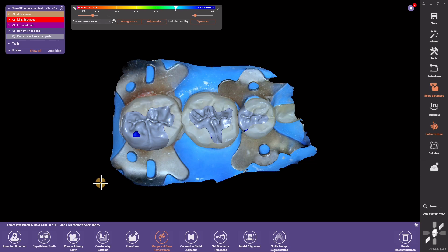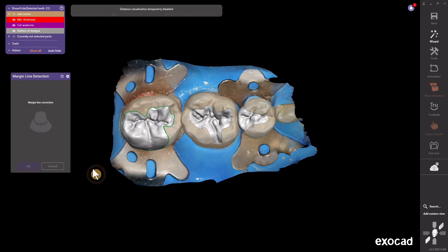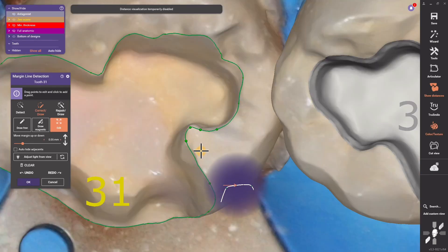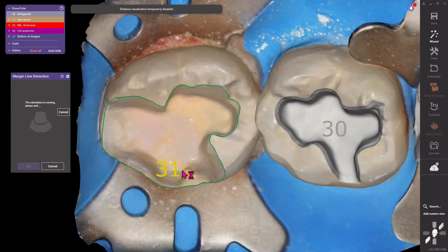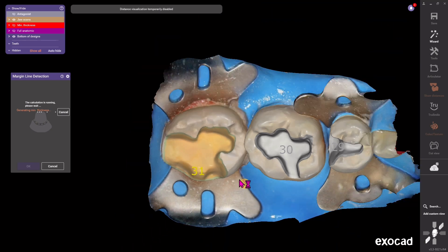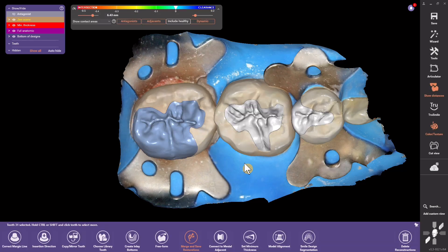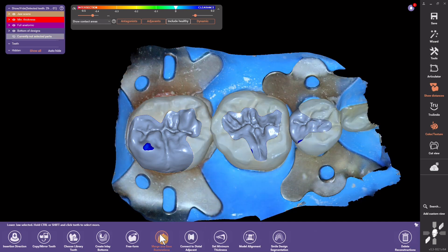If you want to change a margin, click one of the teeth in the group, go to the Margin Line, and tweak it — maybe it had an open margin or you drew it weird. Hit OK and it's going to modify the bottom of the restoration without messing up the top, so you don't lose any of the work you did previously. This is how you jump around in exocad — you certainly don't hit the back button.